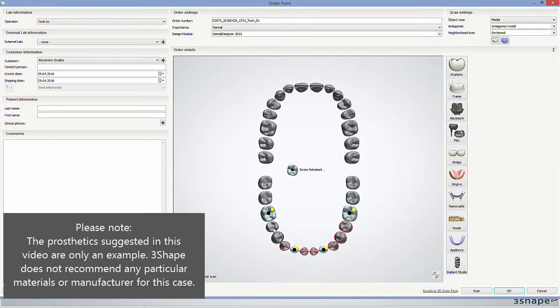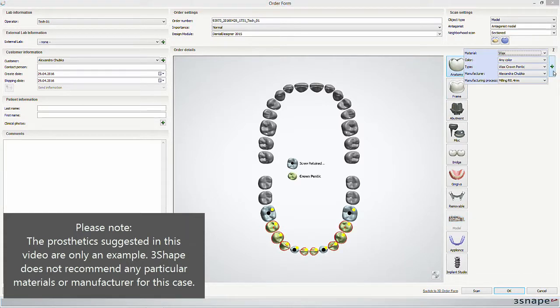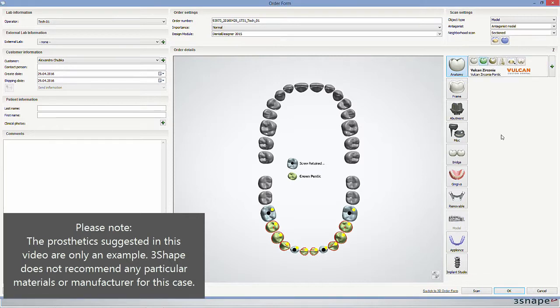You choose the materials and manufacturer based on your preferences. Remember to also adjust the scan settings according to what you've selected.